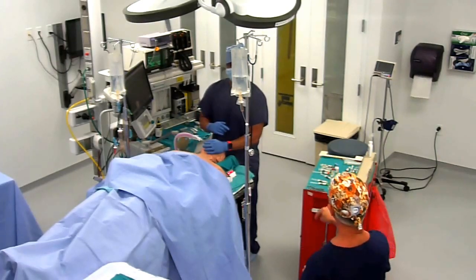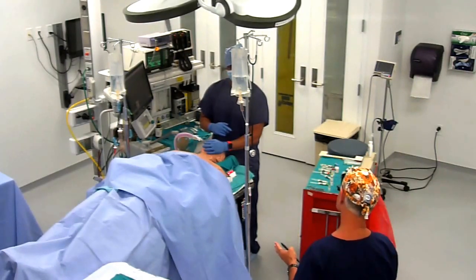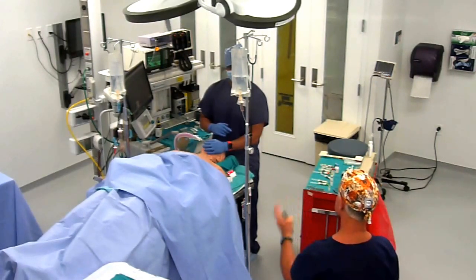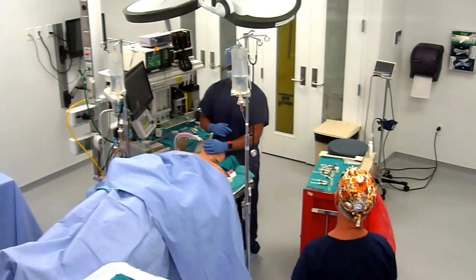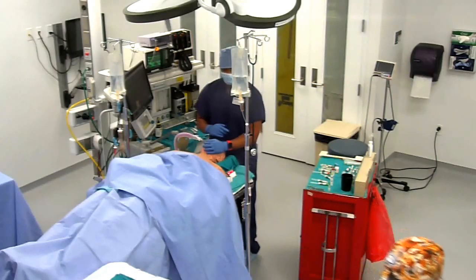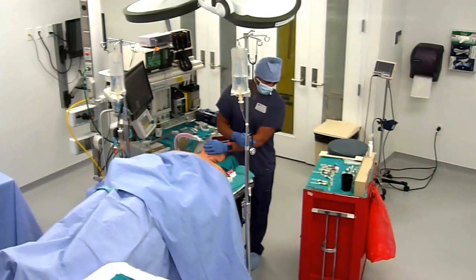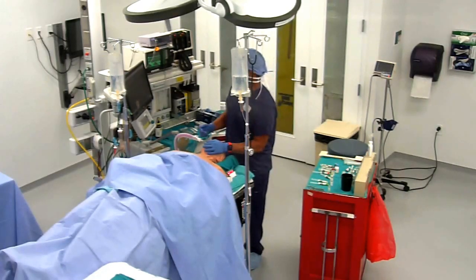That could be staying in here for a little while, or some worst case scenario, you gave a huge dose of muscle relaxant, the case ended really quick, you have to take them to the recovery room, and you put them on a wake-up vent. Let's say that they've got 2 twitches. Okay, 2 twitches. I want to give neostigmine and glycopyrrolate. Okay. Neostigmine is 5 milligrams, 1:1, glyco 0.2 per mil, 5 mils, 5 and 5, heart rate.